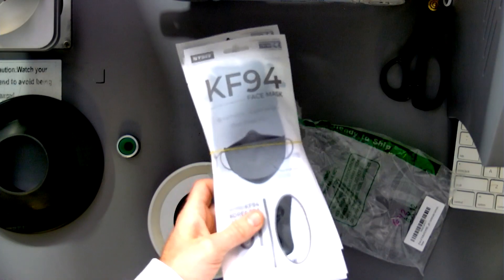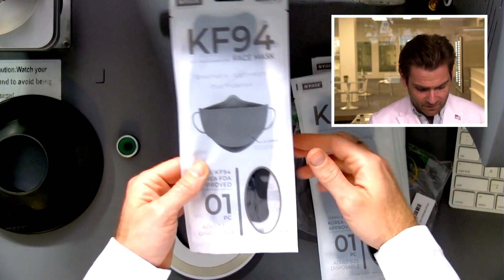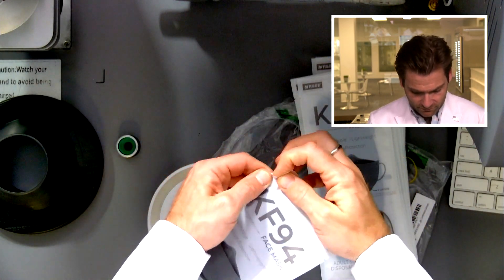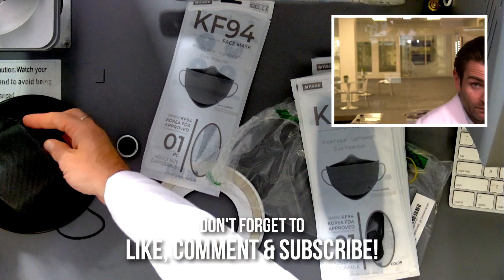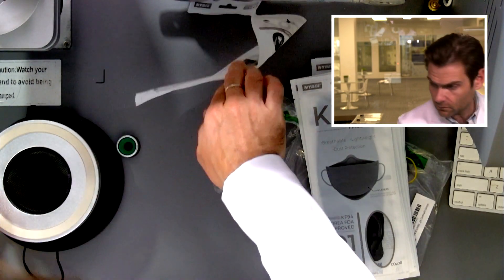Hey everyone, welcome back. We're testing every single mask on Amazon. Today we are looking at KF-94s. They come in a bag and they're rubber-banded together — kind of weird but kind of cool. Most KF-94s are sealed individually, which is just so cool. The Koreans are really great at packaging.